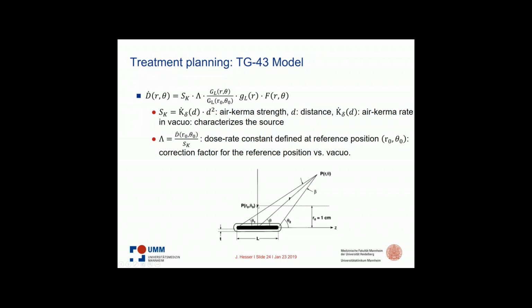And this defines, if we have now not air but water, and we measure that, then we get a correction factor lambda. So it means these two define what is the dose at this reference point in water, the dose rate.